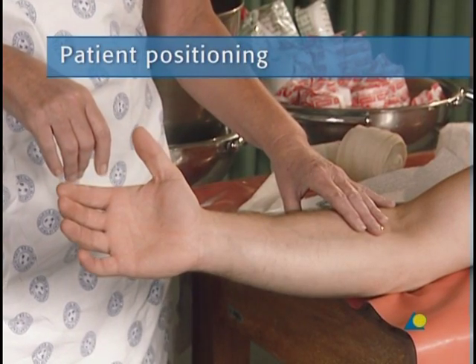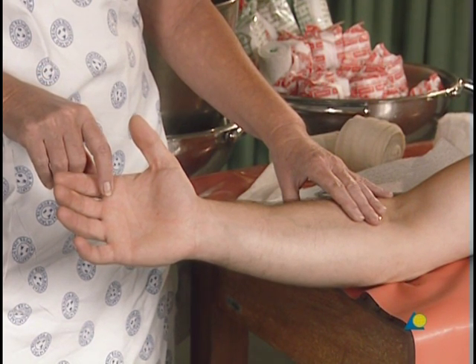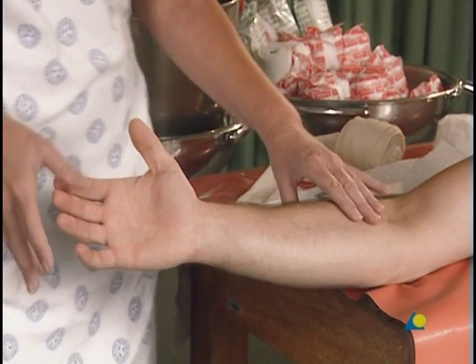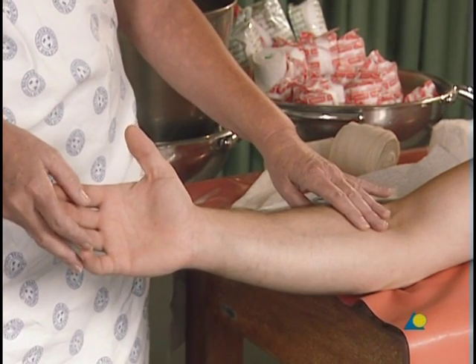The patient should be seated next to a table or trolley, with the elbow at the edge of the table, to allow full access to the forearm and wrist. The proximal border of the volar slab is about two fingers below, or distal, to the crease of the elbow, or the cubital fossa.